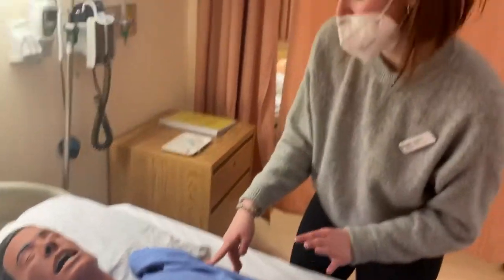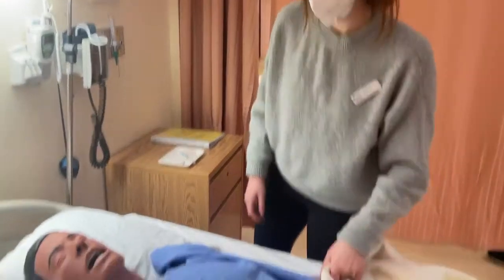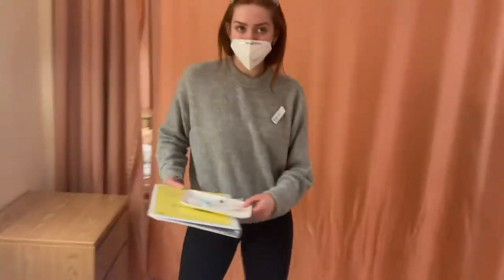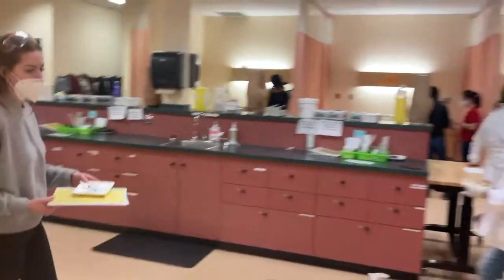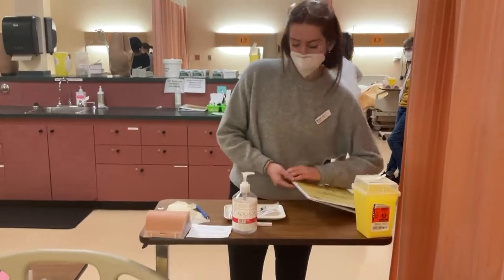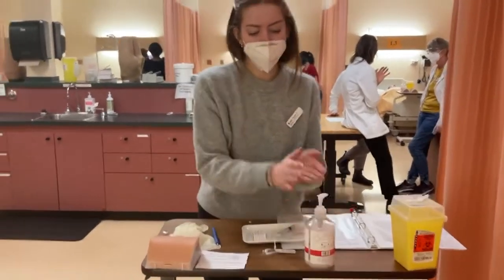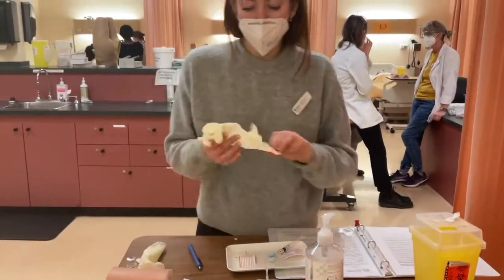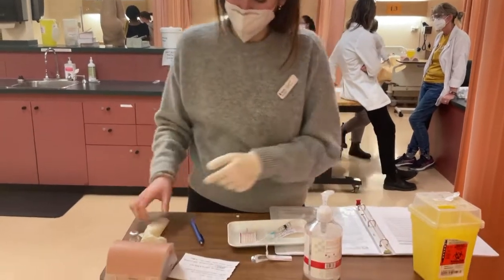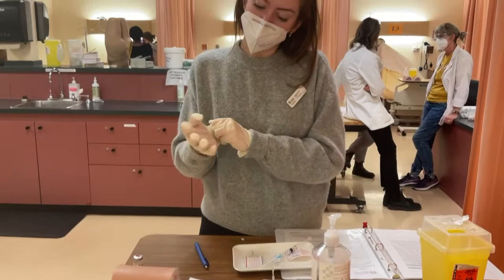So I'm just gonna, it'll be a quick pinch and it'll all be over, okay? He said okay. I'm just gonna cover. And once again, using sterile technique, perform hand hygiene, put my gloves on. Over here, we can actually draw up the 0.5 milliliters. Here's going to be pushing, over top of the wastebasket.